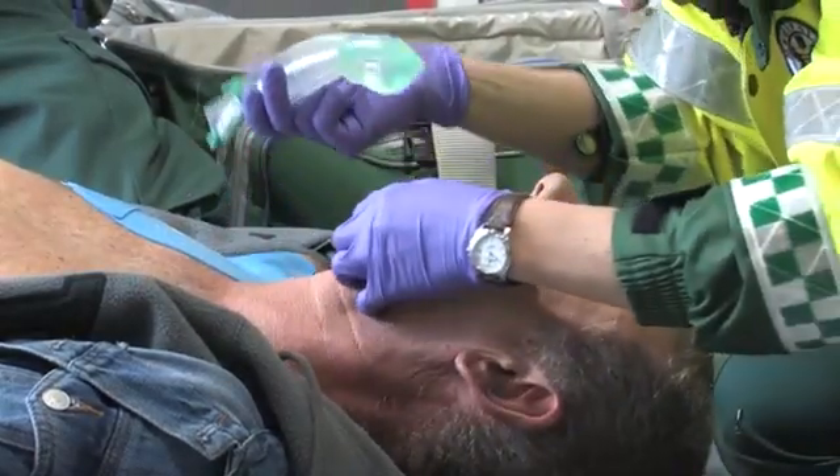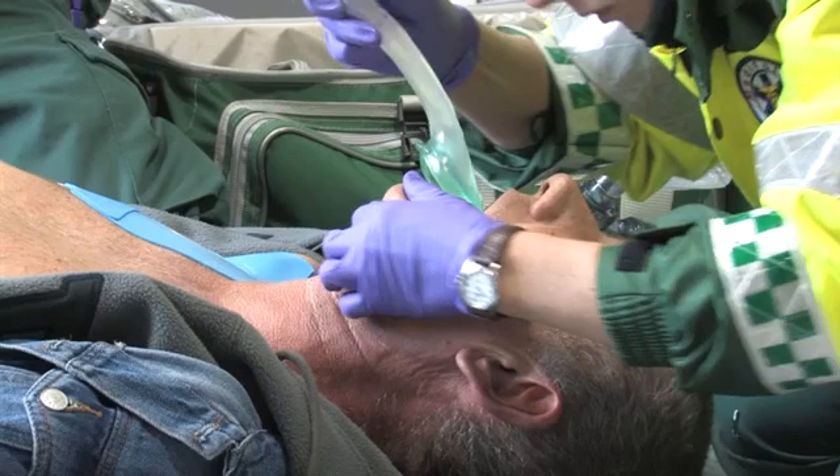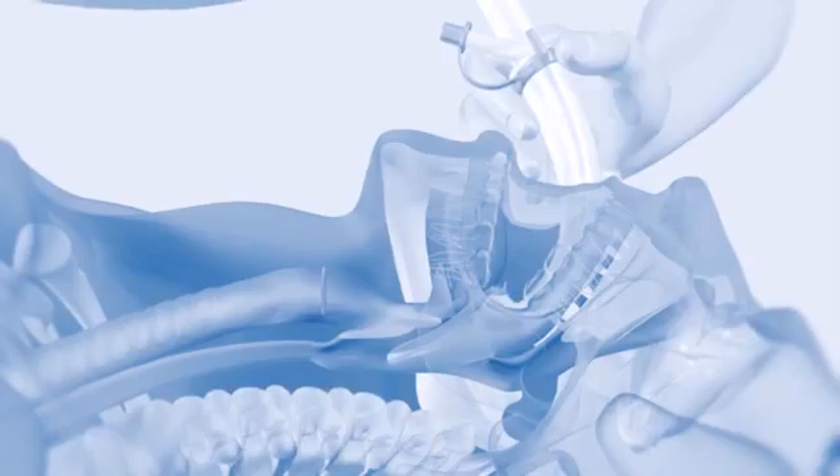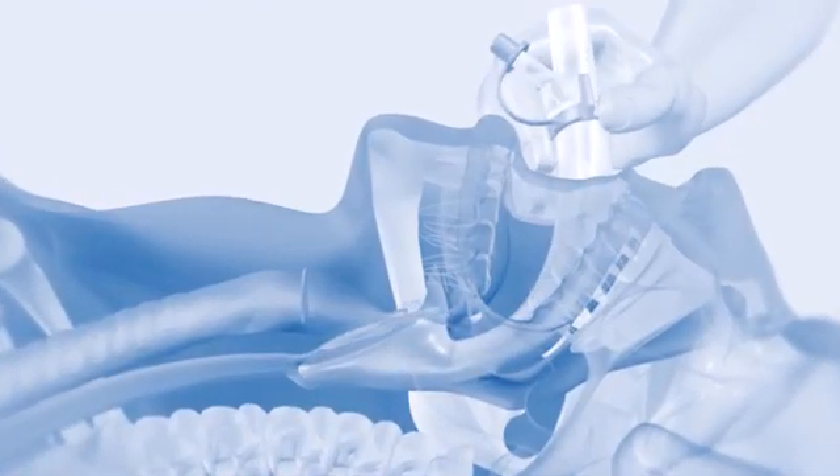Introduce the leading soft tip into the mouth of the patient in a direction towards the hard palate. It is not necessary to insert fingers into the patient's mouth. Glide the device downwards and backwards along the hard palate with a continuous but gentle push until a definitive resistance is felt. Do not apply excessive force. The tip of the airway should be located into the upper esophageal opening, and the cuff should be located against the laryngeal framework. The epiglottis should be held in place by the epiglottic rest. The gastric channel should open into the esophagus.